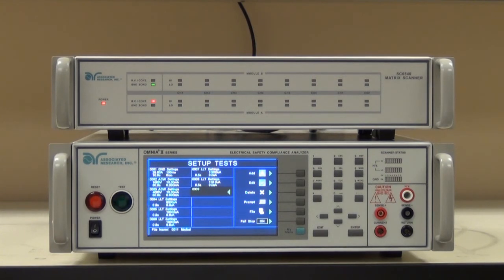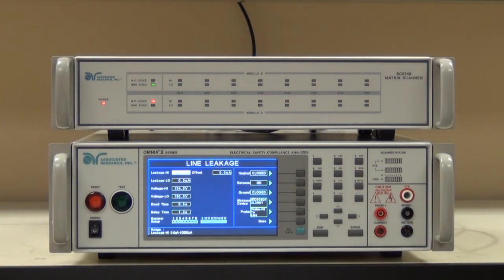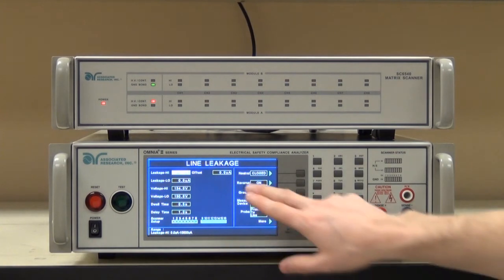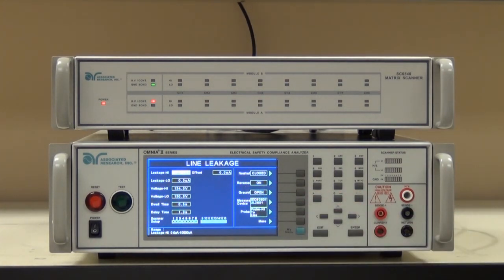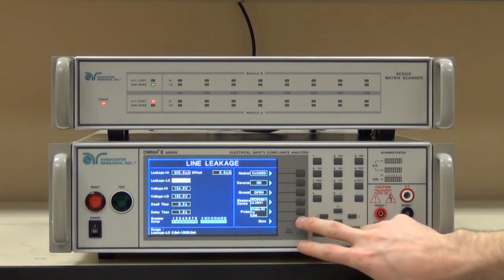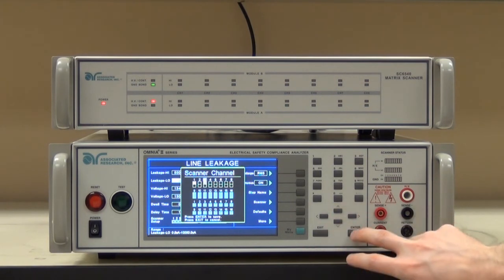Now we have that first patient leakage test completed. For the purposes of this demo, I'm only going to add one more. I could do 8 to cover all combinations — all you'd need to do is cover all fault conditions. I'm just going to add another one with a single fault condition to give you the idea. We'll add line leakage. For this one, I'll do an open ground condition as our fault. The only other thing I need to change is my leakage high limit — for single fault conditions, it goes from 100 to 500 microamps. I do need to set my scanner just as I did before — we're still dealing with patient lead 1, so I'm setting channels 1 and 3 both high.